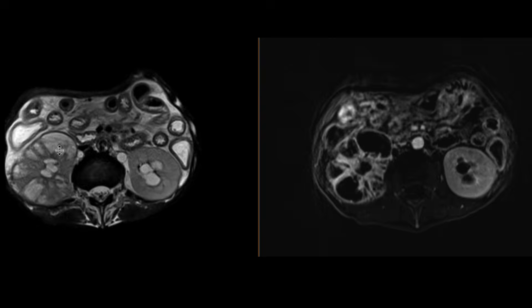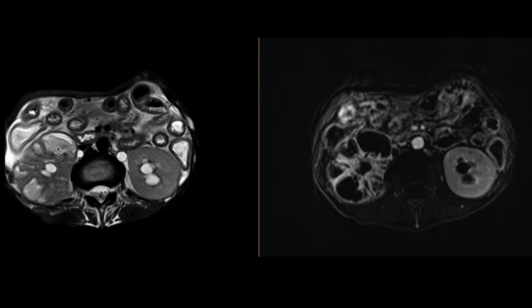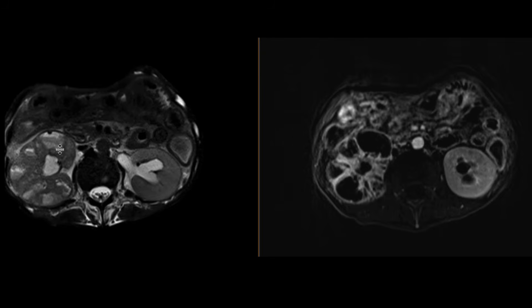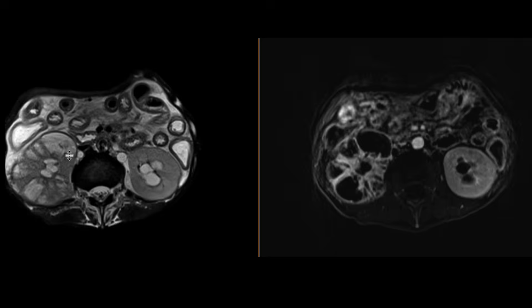Looking inside one of these collections, we can start to see non-dependent areas of T2 hypo-intense signal, and perhaps in other locations as well.